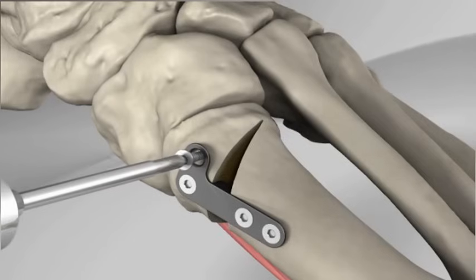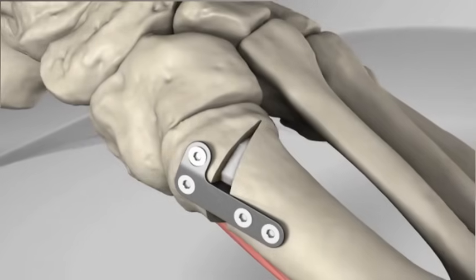Screws are then placed in the remaining holes in the plate and a bone graft substitute is placed in the gap.